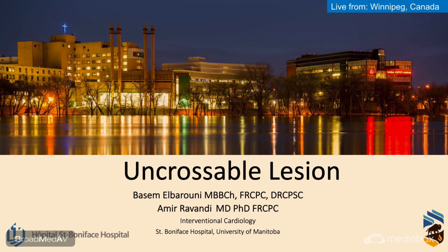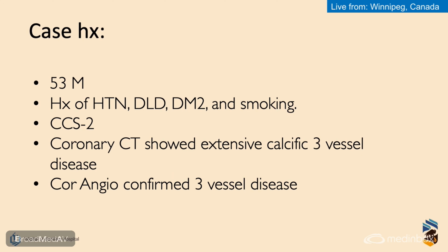Great, thanks. So I'll go through the case. It's a very interesting case of an uncrossable lesion. So I'll introduce the case history. This is a 53-year-old gentleman who has an extensive vascular history of hypertension, diabetes, smoking, dyslipidemia. His index procedure was done for outpatient class 2 angina.